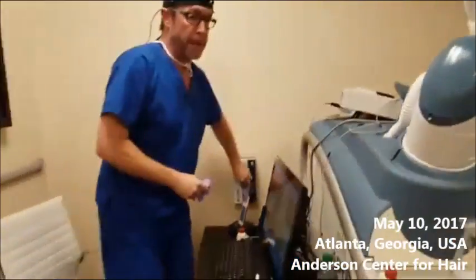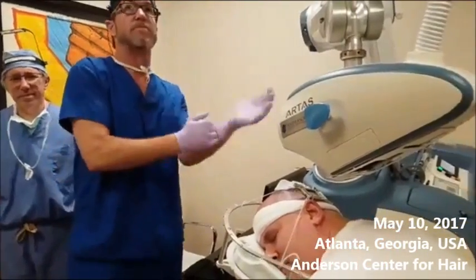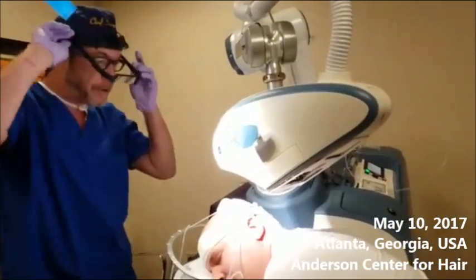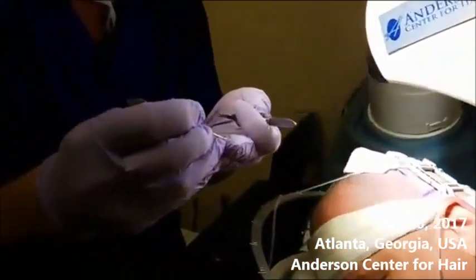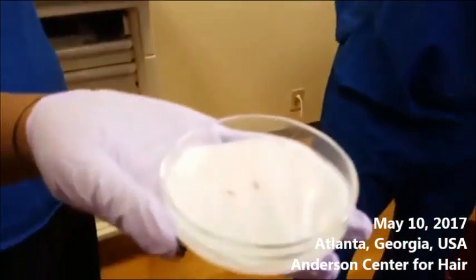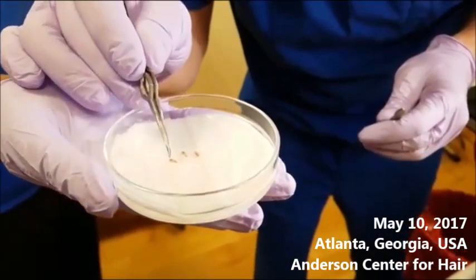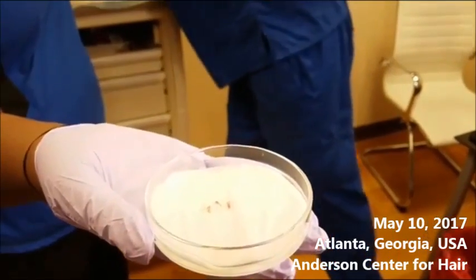I'm going to raise this up and hand the camera back, get my monogrammed gloves, and we're going to have a look-see at the grafts that are coming out here. I want to make sure that what I'm seeing on the screen, which looks perfect, is reflected in real life. Look at that — let's put it in the dish so the viewers can see it. That is a gorgeous three-haired follicle. And there's another one — look at these, they're just beautiful grafts. It's coming right out. This is going to be a good day. My professional team of technicians are going to trim some of this tissue off, and we're going to get about another 2,700 or 3,000 of these today to transplant.